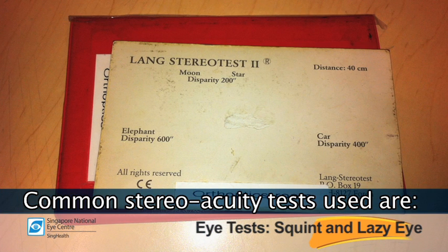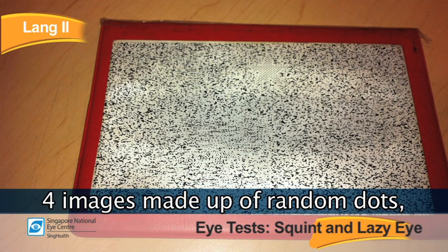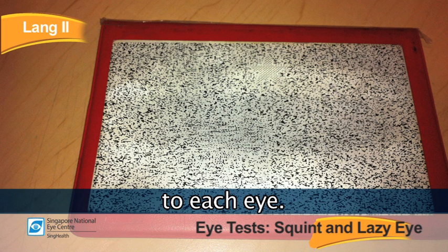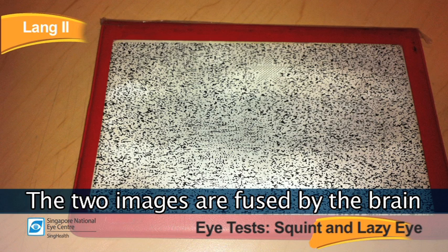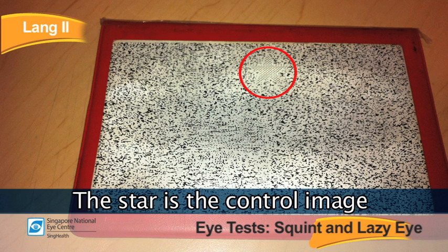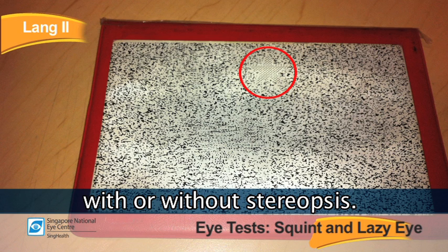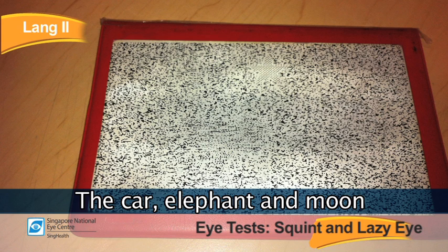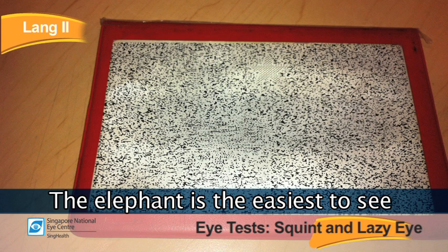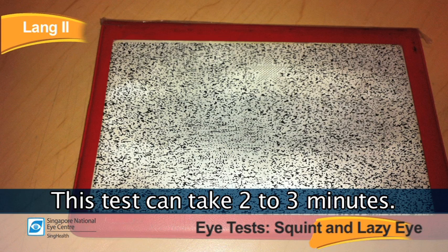Common stereo acuity tests used include the Lang 2 test card, which consists of four images made up of random dots presenting slightly different images to each eye. The brain uses these two images to produce a stereoscopic, or 3D, image. The star is the control image and can be seen by everyone with or without stereopsis. The car, elephant, and moon require stereopsis to be seen. The elephant is the easiest to see, while the moon is the most difficult. This test can take 2 to 3 minutes.